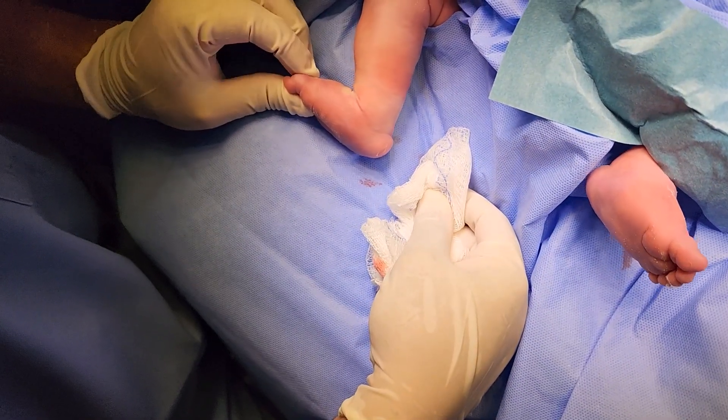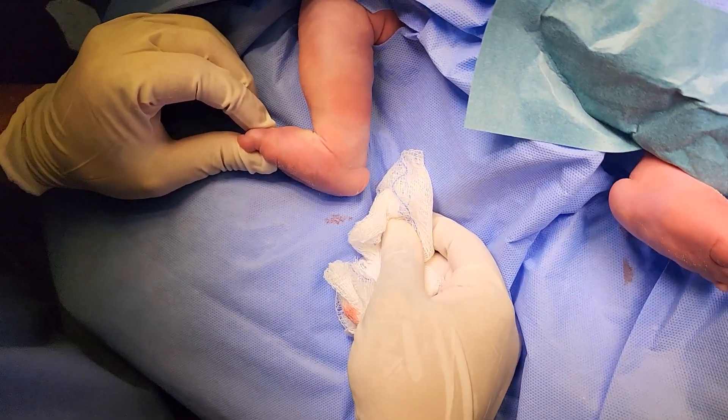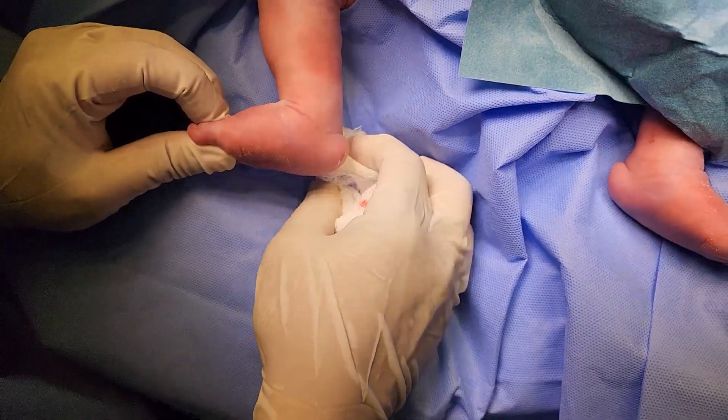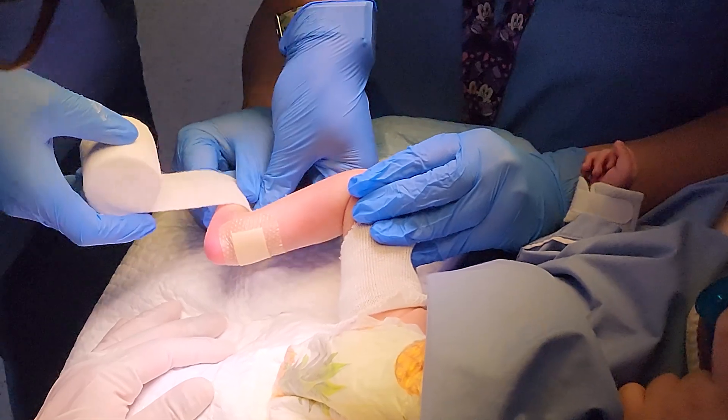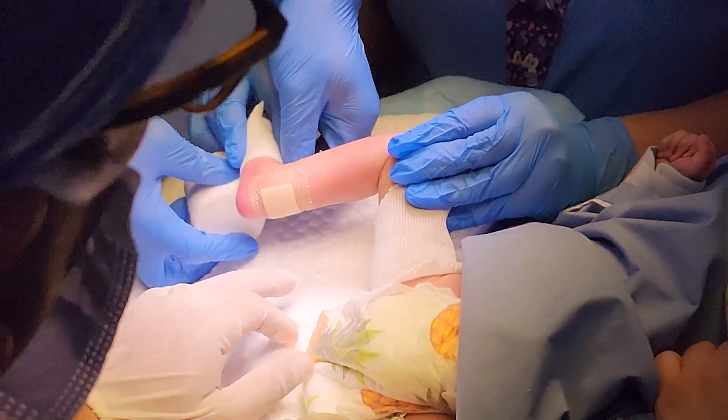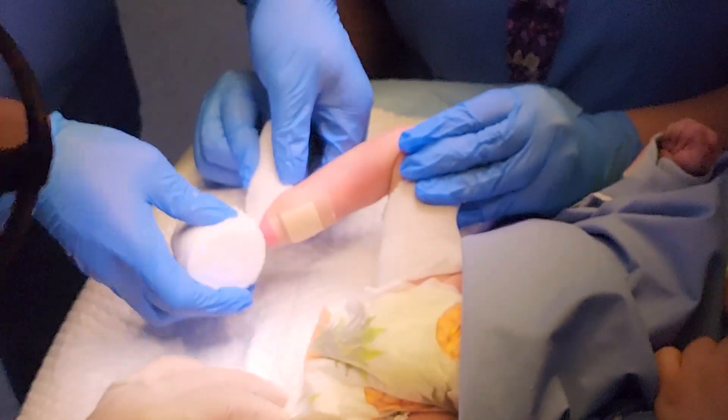Then we check how much ankle dorsiflexion has been achieved. Typically most people look at the forefoot, but please train yourself to look at the hindfoot as well — see where the heel is sitting. After this, we do exactly the same on the other side, and once we finish both sides, we start the serial casting.